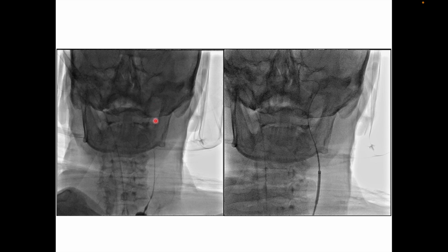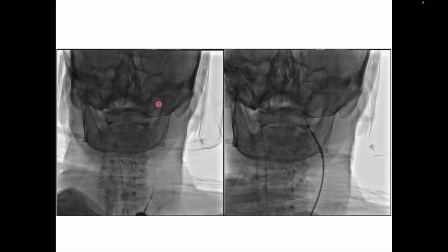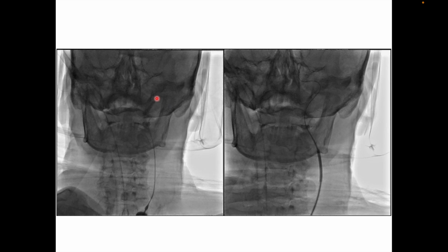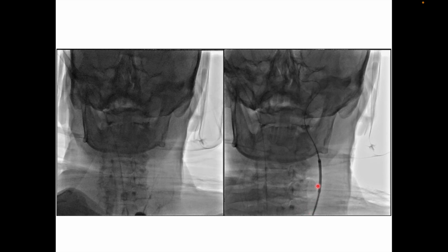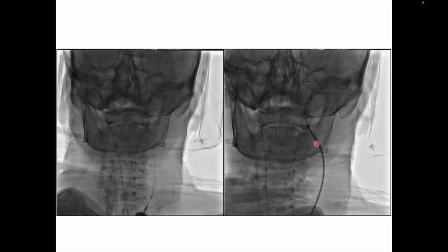Once the micropuncture sheath is in, we take a check injection from the sheath to make sure that we are at the right place. So this is the internal carotid artery because we were doing a stroke intervention. Then we upgrade it to a 6 French, with an 035 wire in. We take the 6 French. This is a long sheath, a 90 centimeter sheath which is coming in.